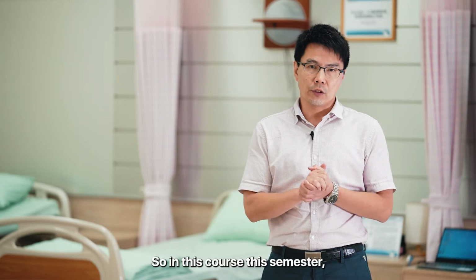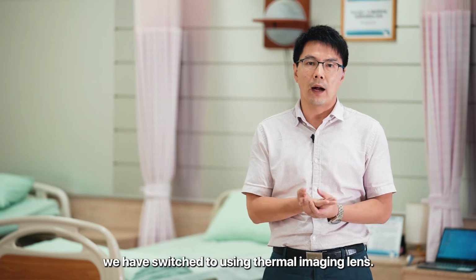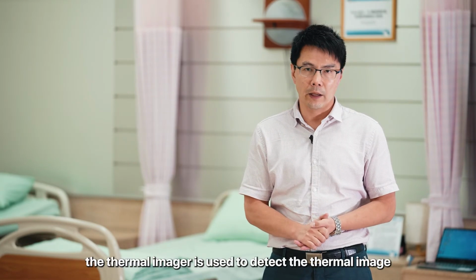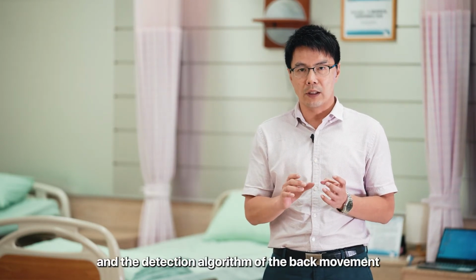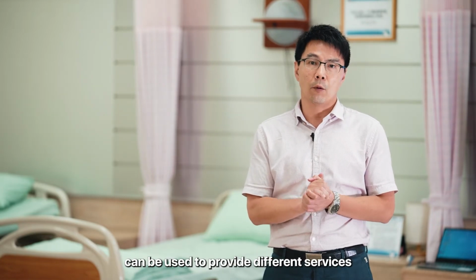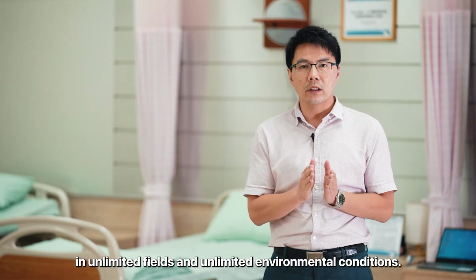So in this course this semester, in order to further solve such a problem, we have switched to using thermal imaging lens. That is to say, the thermal imager is used to detect the thermal image of the human body. Through the learning of thermal imaging AI, the backbone recognition and the detection algorithm of the back movement can be used to provide different services for the elderly in motion detection in unlimited fields and unlimited environmental conditions.